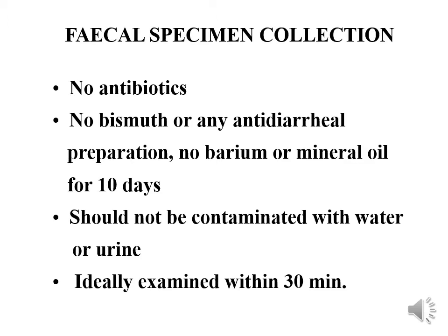In the laboratory, usually we can have two types or groups of specimens. One group is mainly for identification of parasites of the digestive system, for example. So usually it is examination of stool, maybe urine, and maybe sputum occasionally. And the other group is mainly for the blood and tissue parasites. So for a stool examination, for example, there should be a good procedure of collecting the fecal specimen.